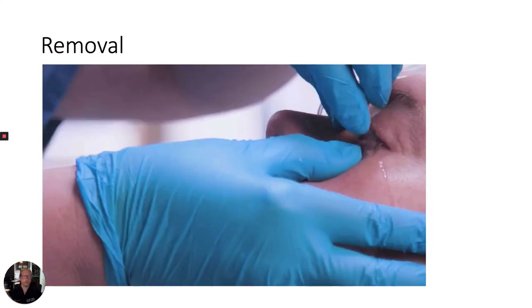When you're ready to remove the Morgan lens, ensure that the lens still has IV fluid flow to cushion the cornea. Next, have the patient look down. Retract their lower eyelid. And finally, slide the Morgan lens gently down and out. Terminate the flow to the Morgan lens.